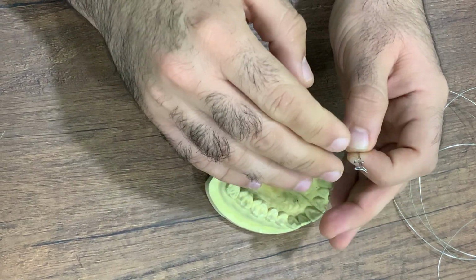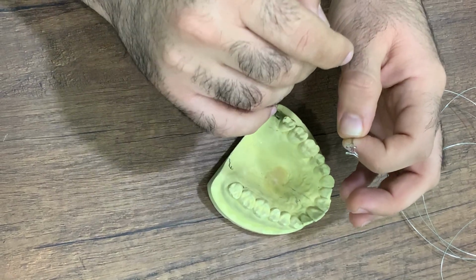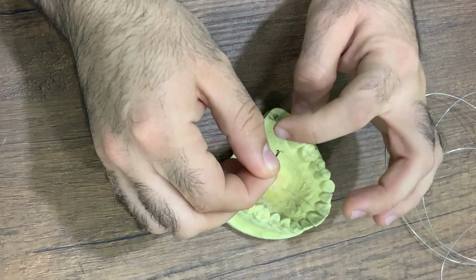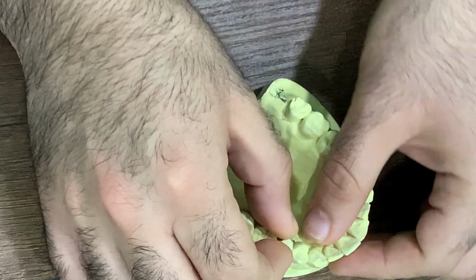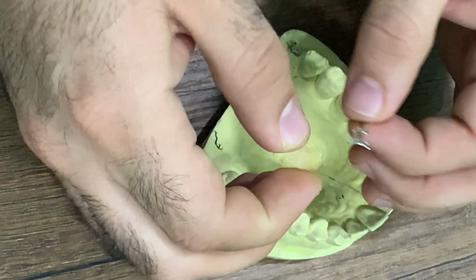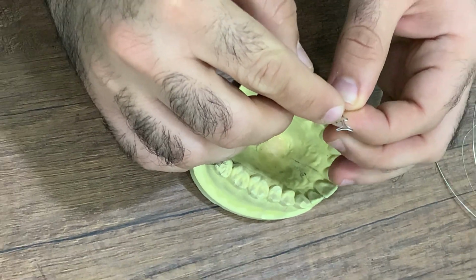Why do we call it T-spring? Because it's similar to the letter T in shape. It consists of T-shaped arms whose ends are embedded inside the acrylic base plate. It is constructed from 0.5 hard stainless steel wire.